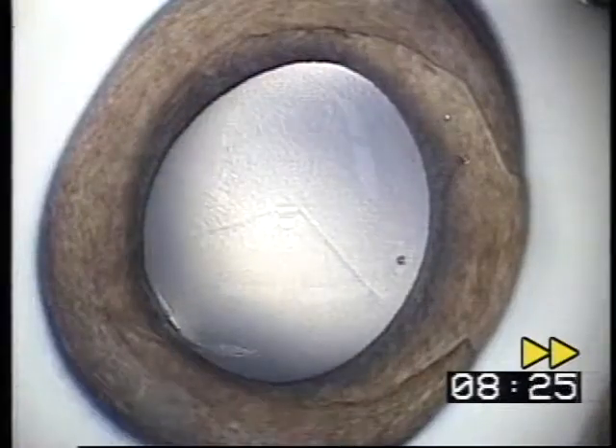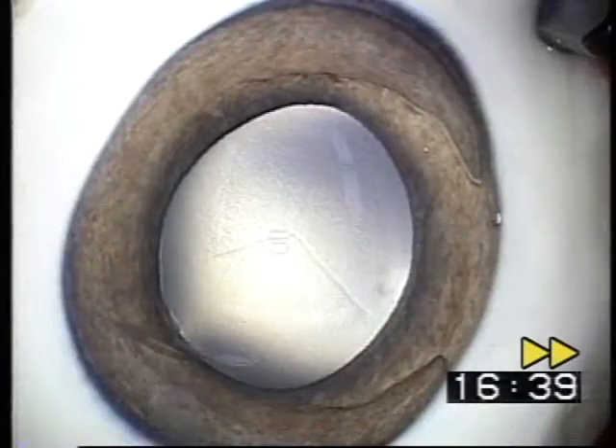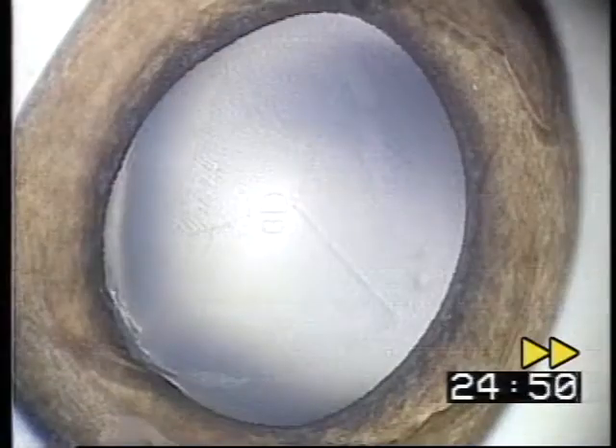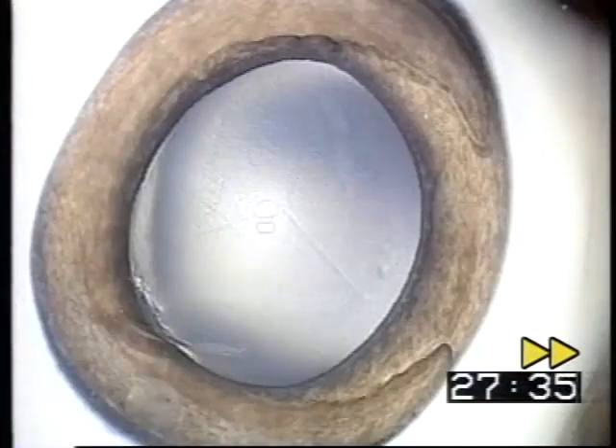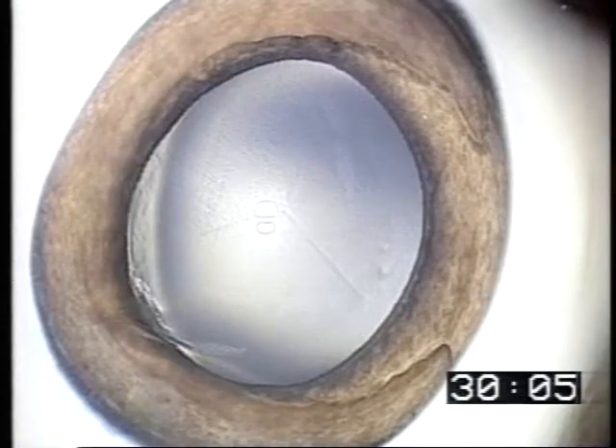This method was applied to 37 patients with cataracts who underwent surgery at our hospital. In all the cases, the visibility of lens was successfully maintained without loss of moisture during surgery. This shows the state observed 30 minutes later — the cornea is not dried.